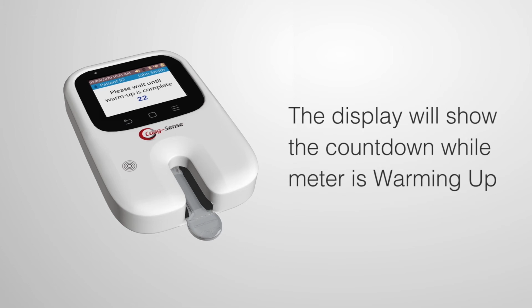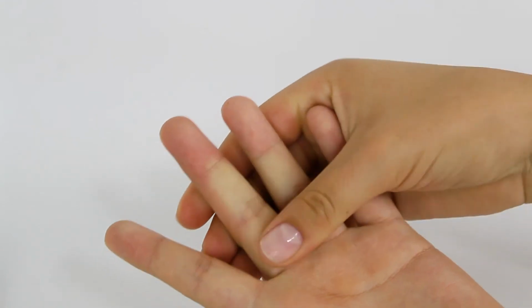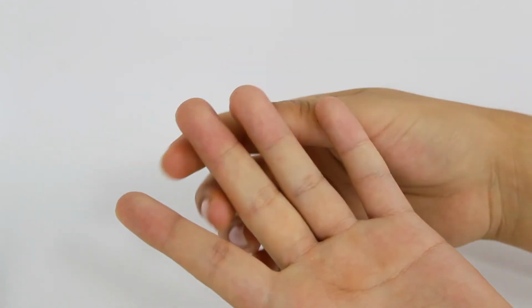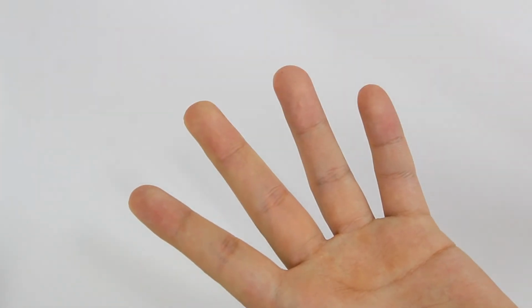The display will show the countdown while the meter is warming up. During this time, hold your hand below your heart and massage the middle or ring finger from the palm of your hand toward the last joint of the finger.